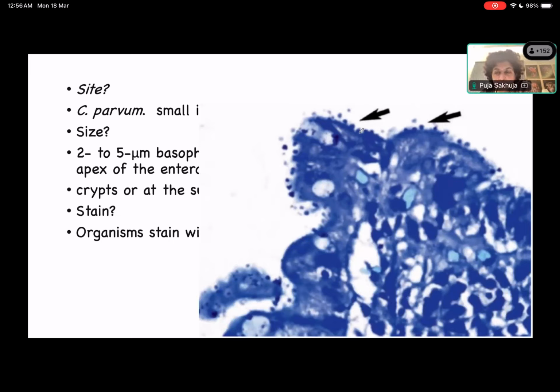So now in the duodenum, if I'm seeing some enteropathic change, but it's not typical of celiac disease, so there's not good villus blunting, there is some neutrophilic inflammation also, and crypt hyperplasia is not there, the patchy pattern. In such cases, much more commonly it is Giardia, and very rarely cryptosporidia or some other organism.